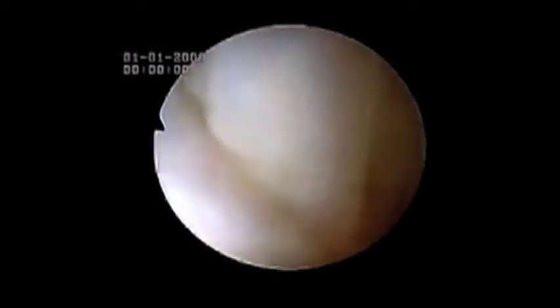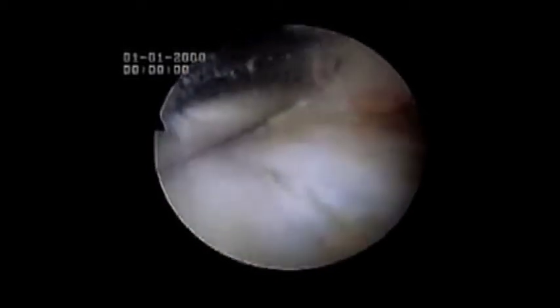The size of the lesion is demonstrated by the fact that the 3.5mm gator resector is only 3.5mm in diameter. Here we are on the top of the meniscoid band, seeing the associated synovitis.